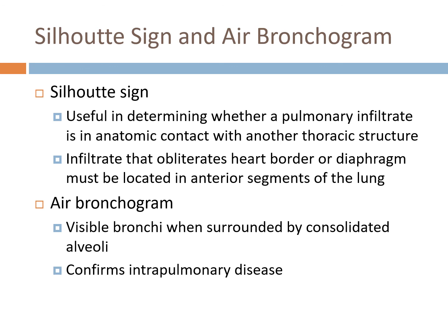If it's an over-penetrated or under-penetrated film, that's technique the X-ray tech is watching for and in charge of. If they have to do another film, sometimes there's too much artifact, or it just wasn't a good quality film.